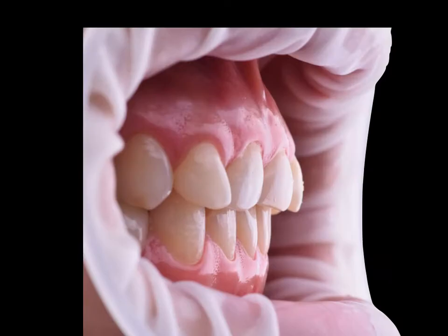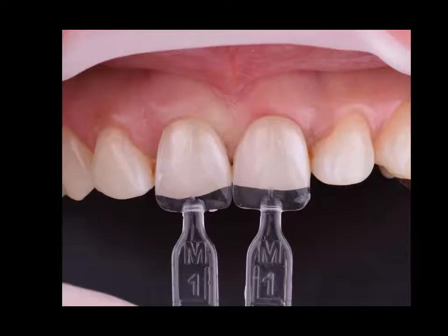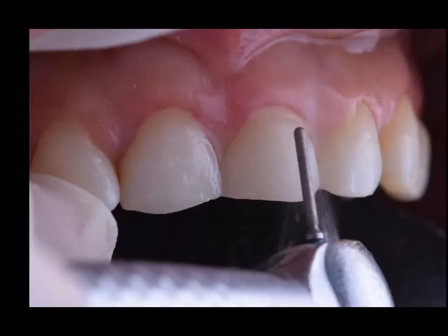So what do we do? Basically, it's a very easy case because the teeth are intruded, so we don't really need to remove too much of both teeth. You measure which Uveneer, the medium or the large. In each template, they will say M, which is medium, or L, which is large, and then the number of the tooth, if it's upper right one or upper left one. So you will measure which direction you want to go, medium or large, and as I said, even if the teeth are intruded and there is no need to remove the tooth, you're still going to rough it with a diamond burr to increase retention.